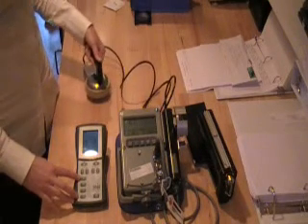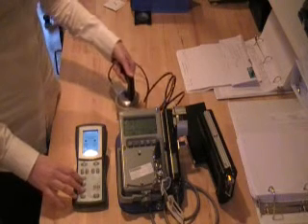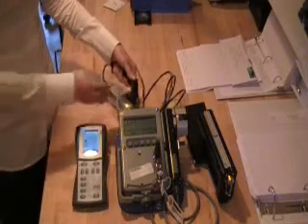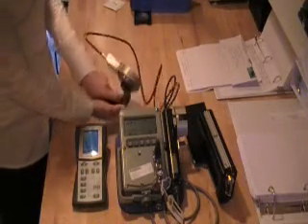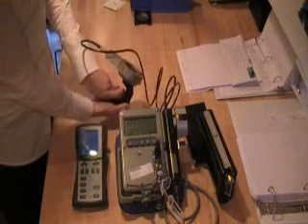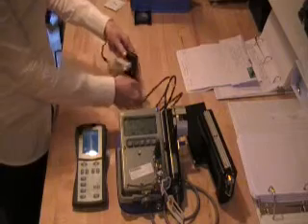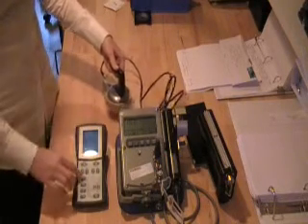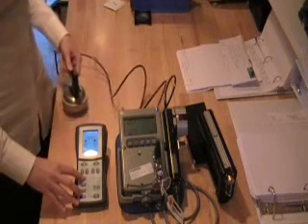Now one of the other advantages of this is as I move in and I go ahead and increase my contamination level accordingly back up to the 5,000 counts, if the student were to turn the probe, you can see that it is reinforcing the basics that my probe needs to be looking down onto the surface. As I move away, again, I will decrease it down to background levels again.